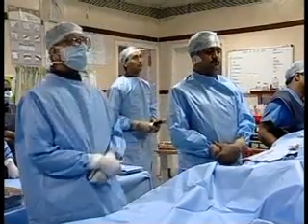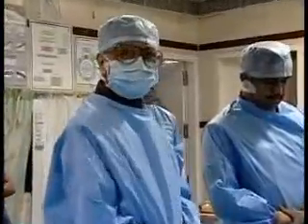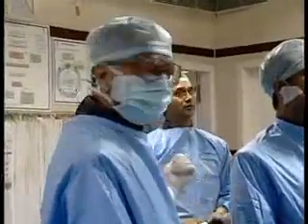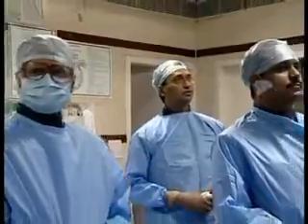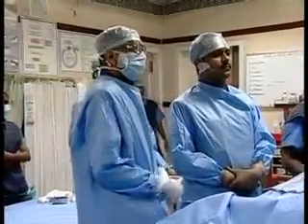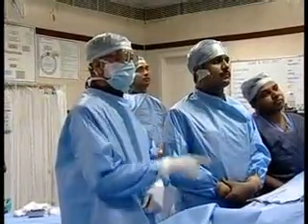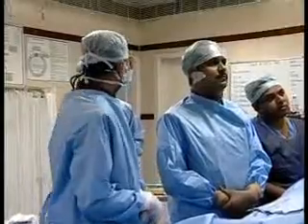Dr. Narasimhan? Yes, good afternoon. From the CARE Cath Lab, we have Dr. Lawrence and Dr. Anuj joining me in this procedure, and we have our Cath Lab team with our techs. We have done one side, the renal denervation, and we are going to demonstrate on the other side.